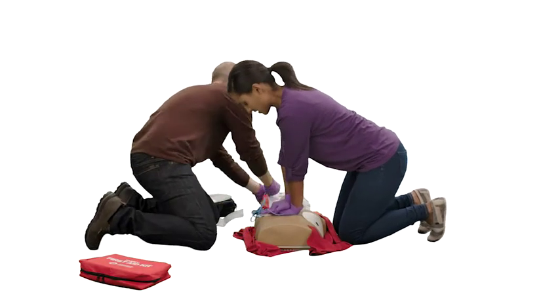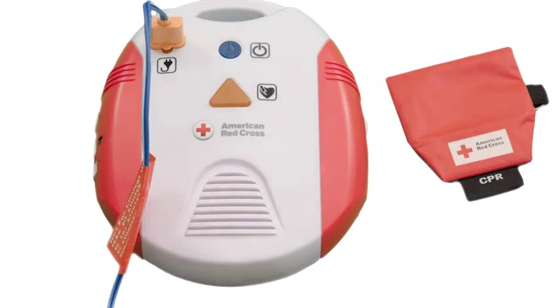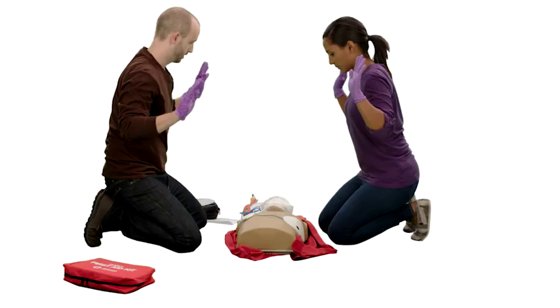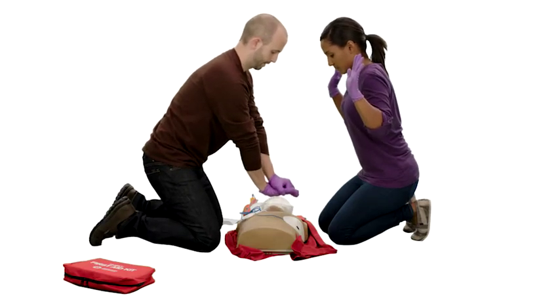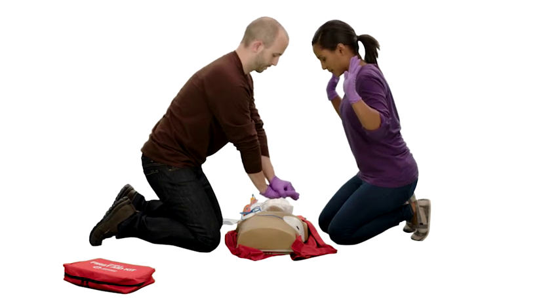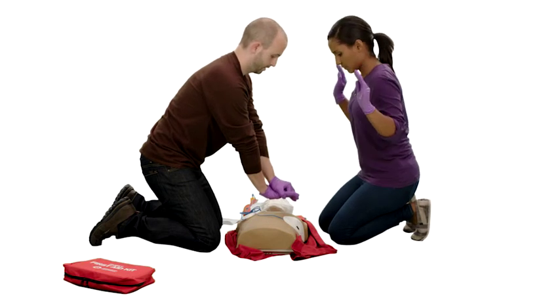When the AED prompts, analyzing heart rhythm, Responder 2 says, "Clear." Then the responders switch roles. Responder 1 will now operate the AED, and Responder 2 will now provide CPR. The responders should switch roles in this manner each time the AED analyzes the heart rhythm.